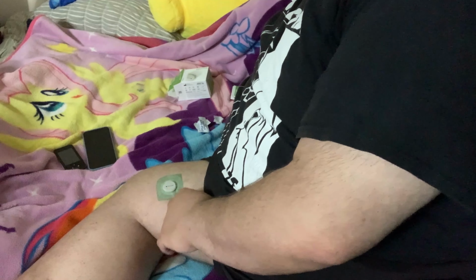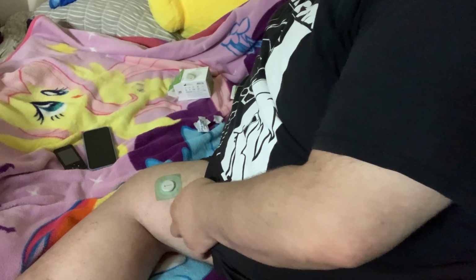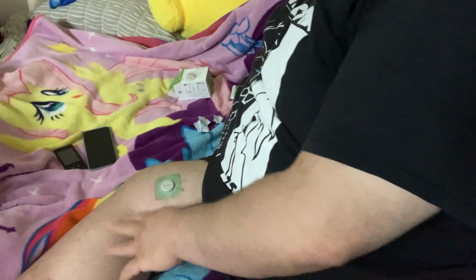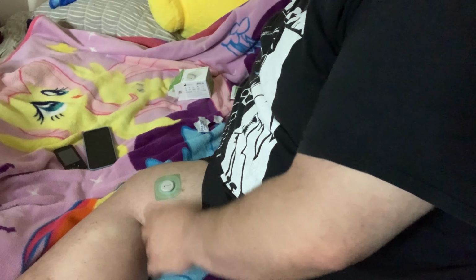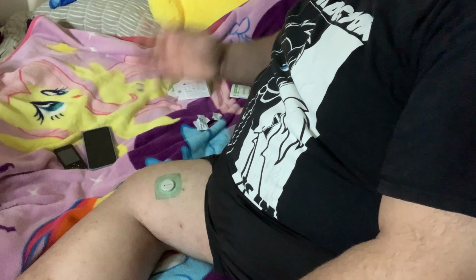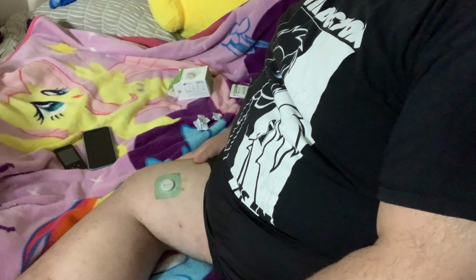It feels good if you have it on the fatty part. I have a lot of fatty parts on my arm, my belly, the legs. I was thinking about the calves, but I don't think that's a good idea. But hopefully this area will be a good idea. And then you guys will see me have the Dexcom G7 sensor on my leg, and it's going to last about 10 days.